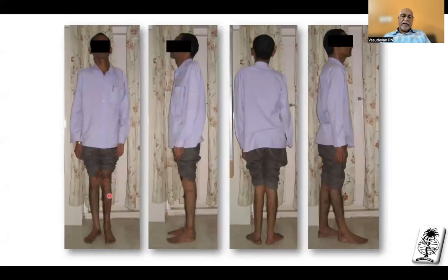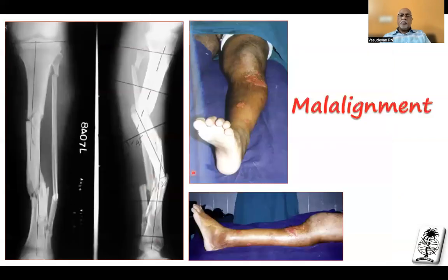This is another case — a segmental fracture treated by an Ilizarov with one ring proximally, one ring in the middle, and one ring distally. Within the frame the whole thing got deformed. The alignment was acceptable — the knee and ankle were good — but there was shortening, a compartment syndrome in the foot, and a mild medial translation deformity creating a varus.